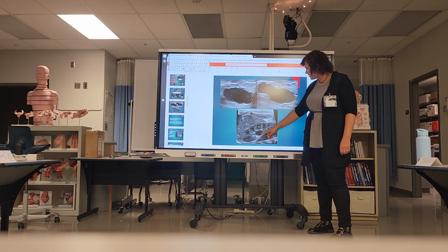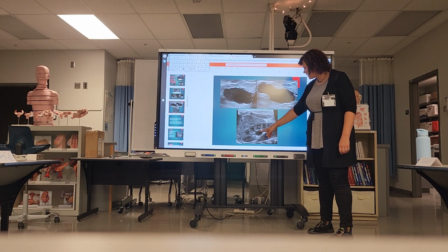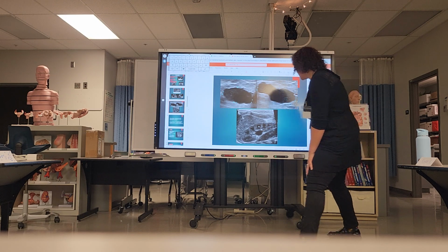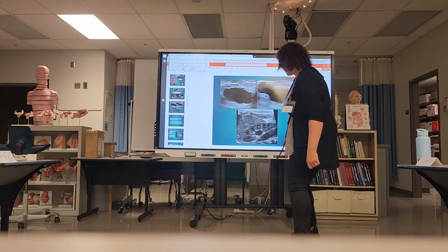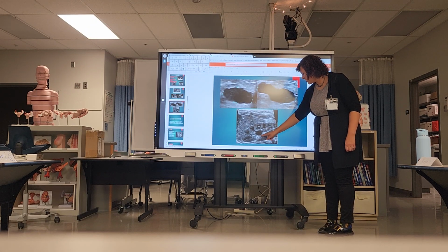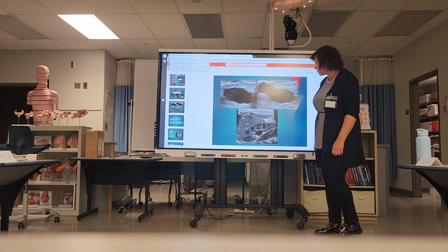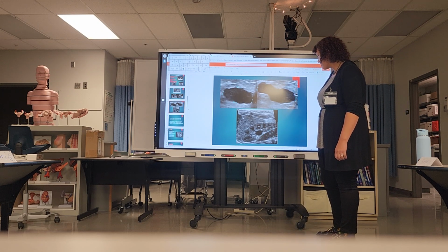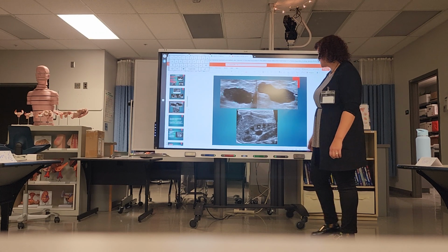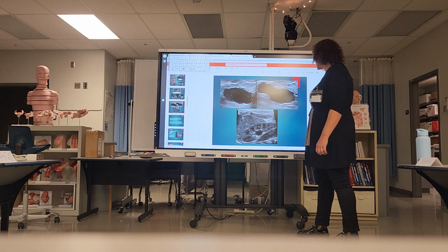So this is a kidney, and right here is a dilated ureter, and it's filled with urine. How can we tell that it's filled with fluid? The enhancement. Yeah, there is some enhancement down here. So the top ones are masses, they're not fluid? Yes, this is a mass.